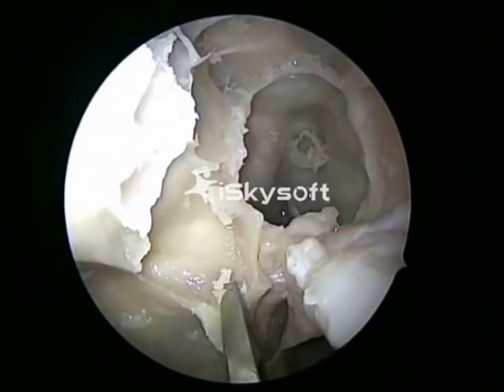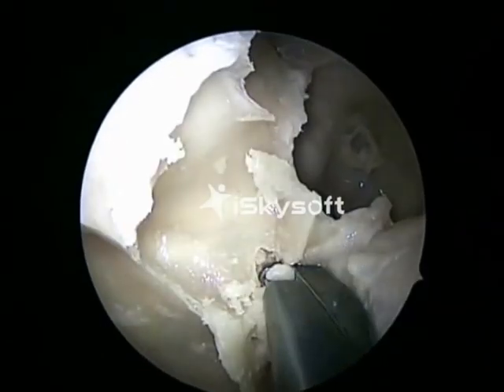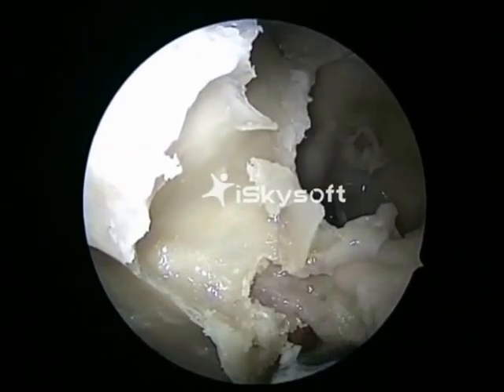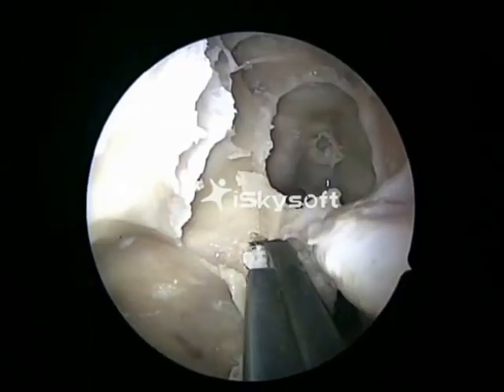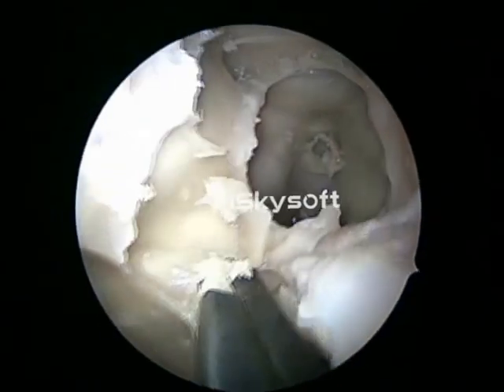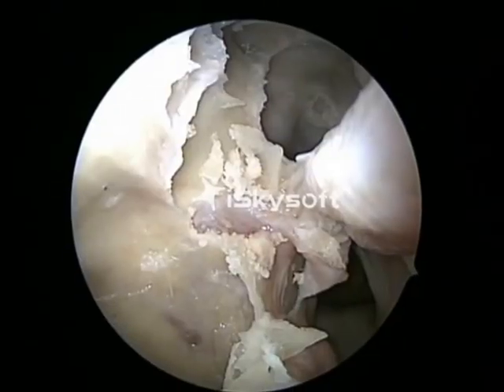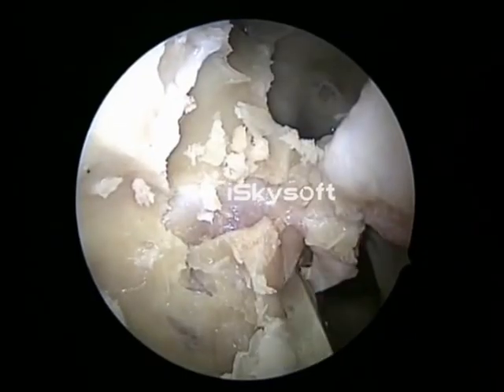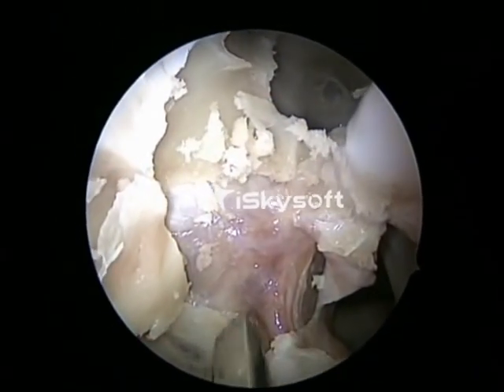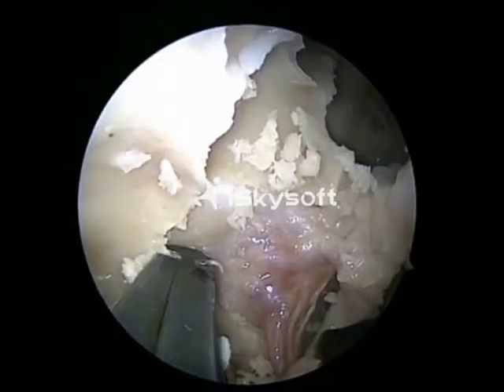The next exercise would be exposure of the pterygopalatine fossa, and for that we use a Hajek-Koffler punch to take off the crista ethmoidale, and we'll also remove the posterior wall of the maxillary sinus. Once the posterior wall of the maxillary sinus is removed, it's usually removed with a diamond burr in a live situation. You can see the descending palatine branch very clearly there. That's the terminal branch.